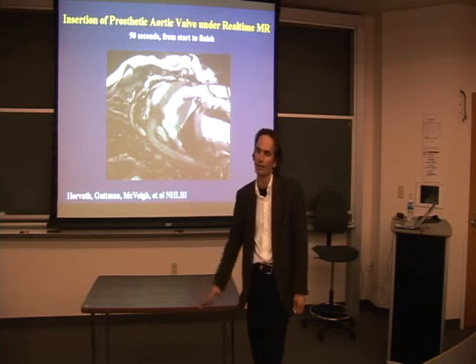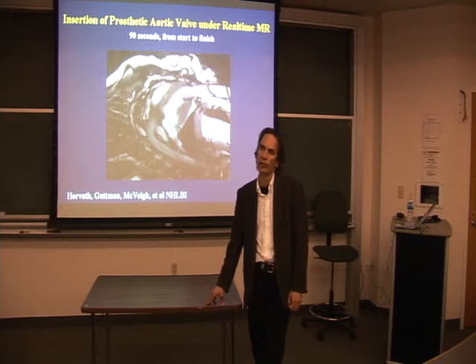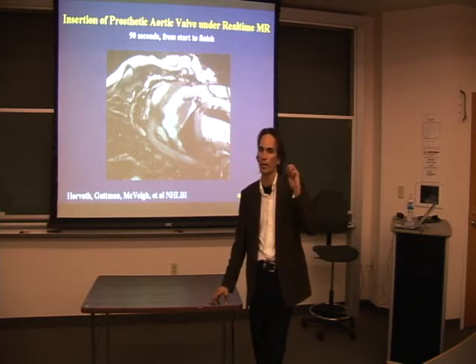But that's it. The latency is 200 milliseconds. The time that we transfer those data, and reconstruct it, send them back, do all that. It might be broken. A big delay. Yeah. That's all just data transferring and recording and then putting it up on the screen.